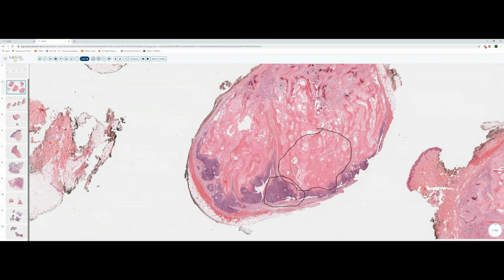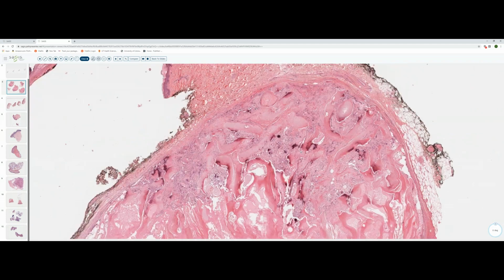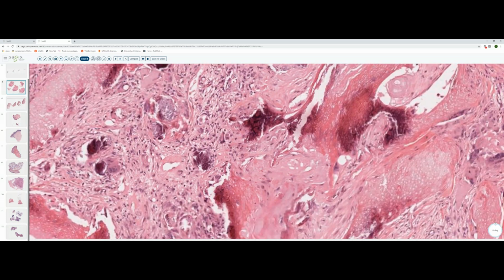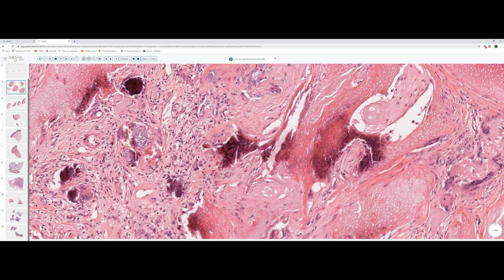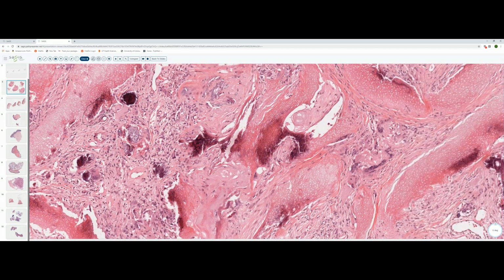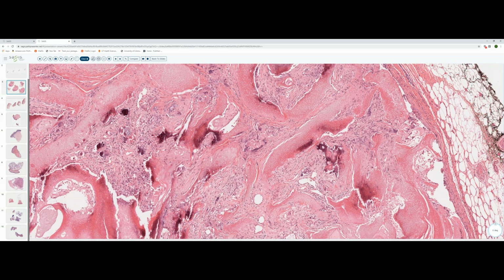And the shadow cells sometimes will begin to calcify. We're seeing a little bit of that up at the top of the tumor, where you can see these shadow cells becoming somewhat basophilic due to the deposition of calcium salts. And then furthermore, these calcified shadow cells can serve as a nidus for ossification within the stroma. So sometimes in a real old pilomatricoma, all you'll see are calcified shadow cells and bone. So this is a lesion which changes over time.